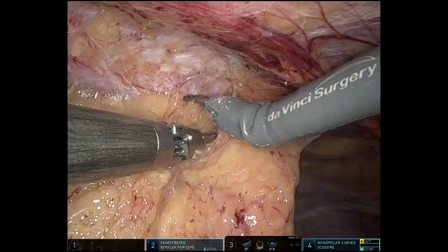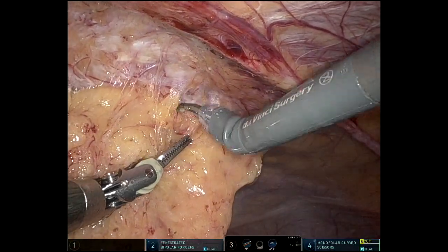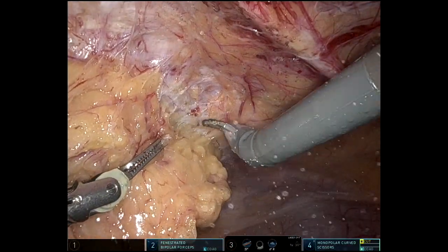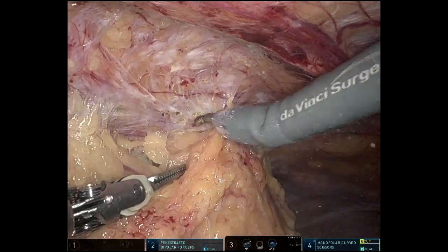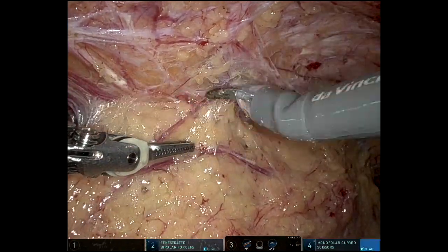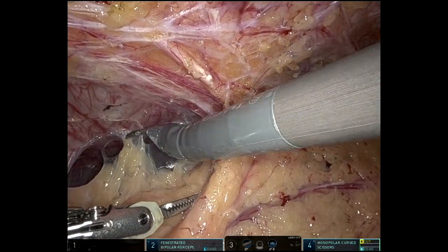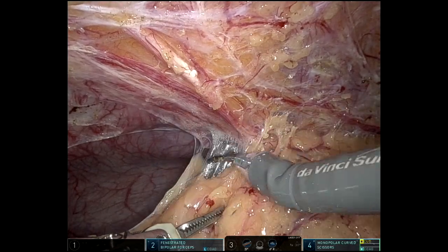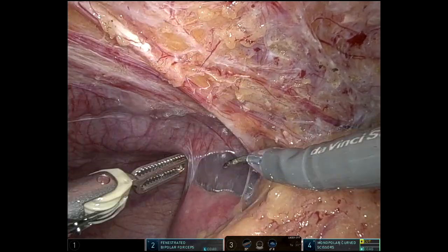With these cases — minimally invasive surgery after laparotomy — you just never know how much scar tissue you're going to get into. I spent about 45 minutes at the beginning of the case just taking down adhesions. This is just the omentum to the midline. I didn't go about freeing all of those up, but enough to complete the operation.